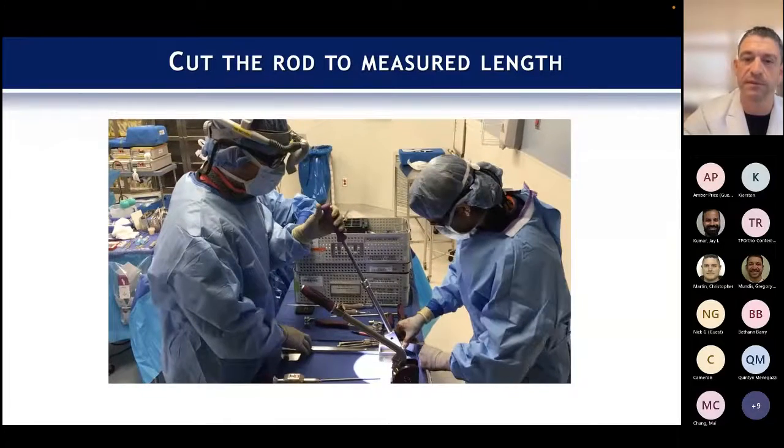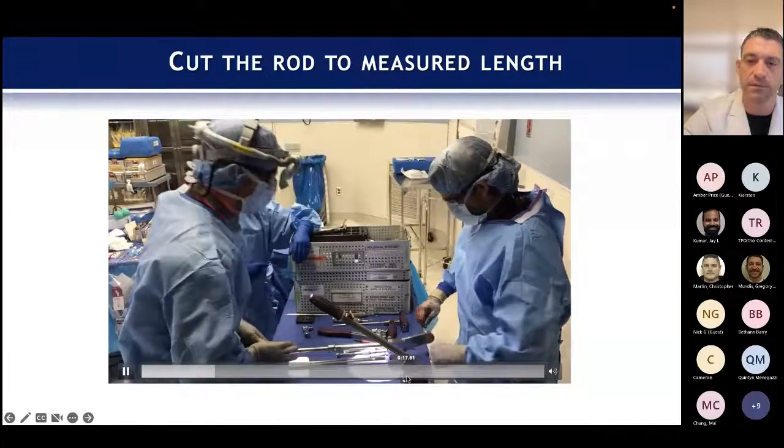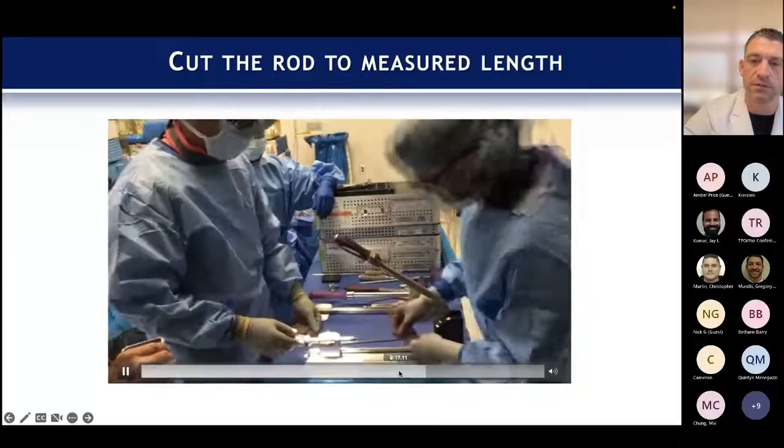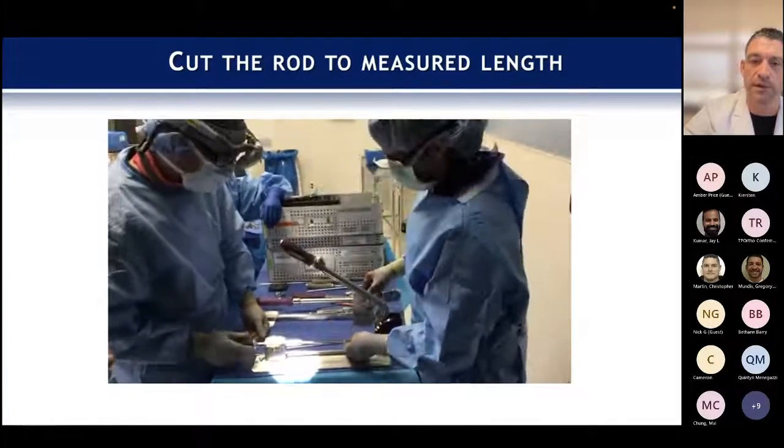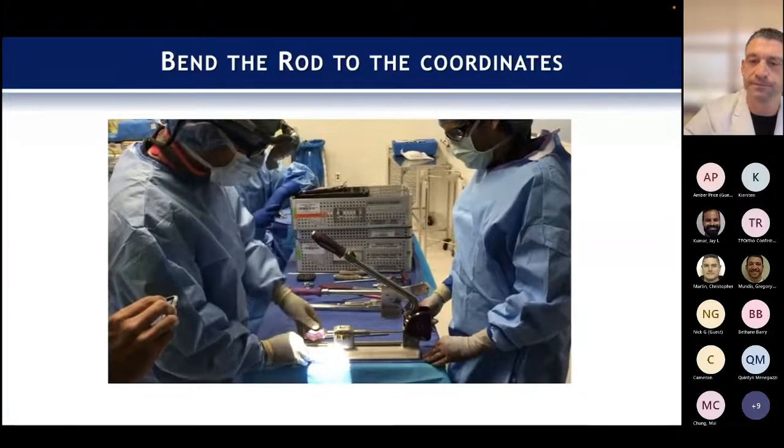So here's where we're cutting it. And then coordinate by coordinate, you basically make your rod.